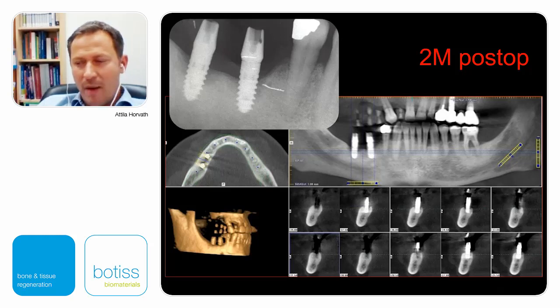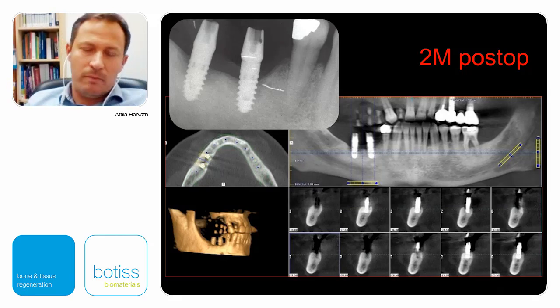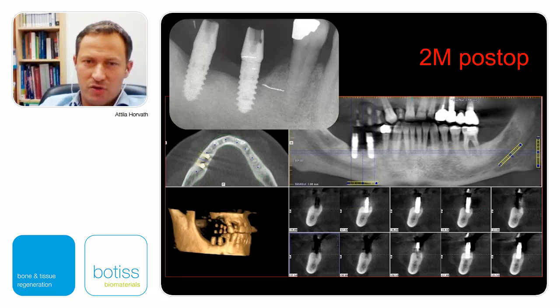Again, remember what we've done in the perio case. We just reconstructed normal biology, Mother Nature. So we got rid of this awful crown, we cleaned the implant, reduced the bacteria amount, we reconstructed the healthy keratinized and attached tissue, and most probably the bone which was always there but demineralized. The body somehow recognized that, okay, bacteria is gone, I'm in a very healthy situation again, so let's remineralize these peri-implant tissues.